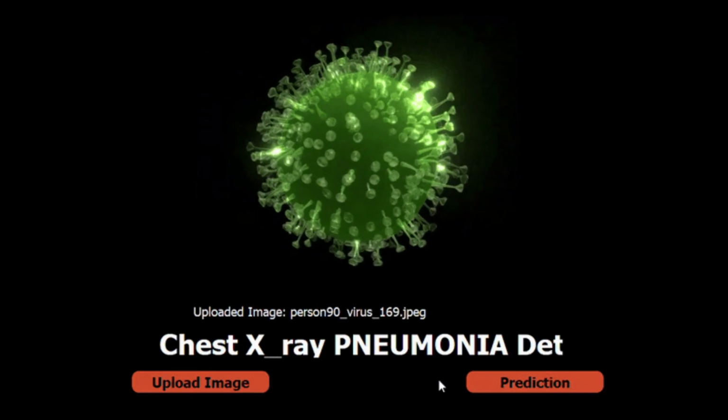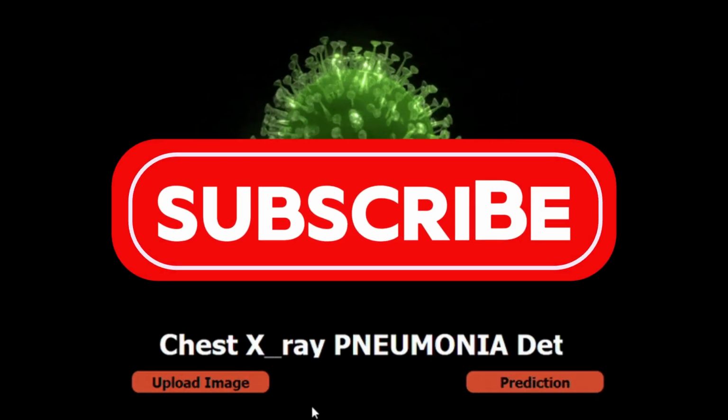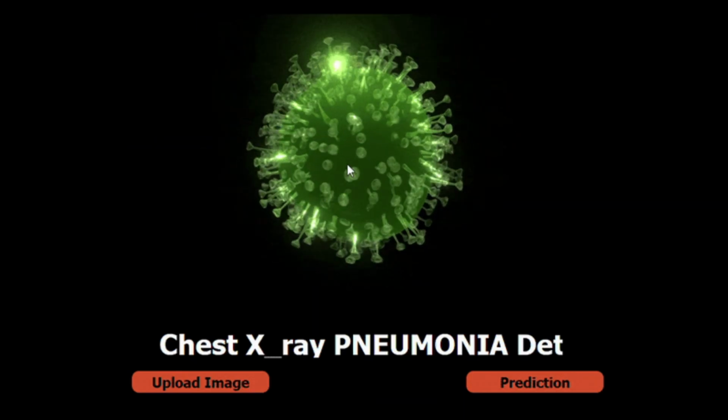So in this video, I will introduce you to a deep learning project on pneumonia detection with Python programming language.